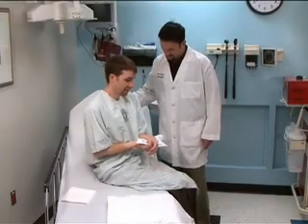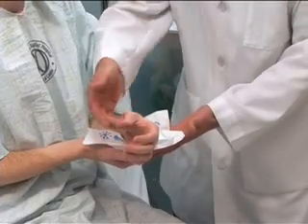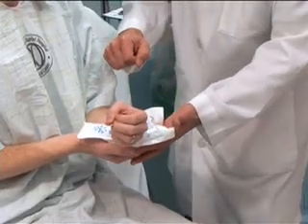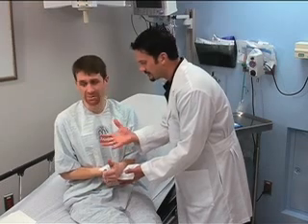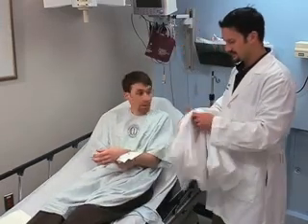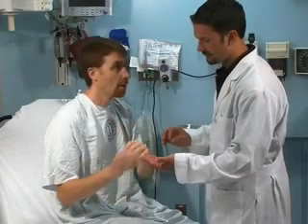Before placing a splint, carefully examine the injured extremity. Failure to expose the injury site fully may result in unidentified injuries and subsequent poor outcomes. Evaluate pulses, motor function, and sensory function to determine whether emergency intervention or evaluation by a specialist is necessary. Treat skin or soft tissue injuries appropriately before placing a splint. Analgesics or anesthetics may be necessary to control pain during the splinting procedure. Place the patient in a comfortable position that allows you to have adequate access to all sides of the injured extremity. Remove all jewelry from the involved extremity before beginning splint placement.